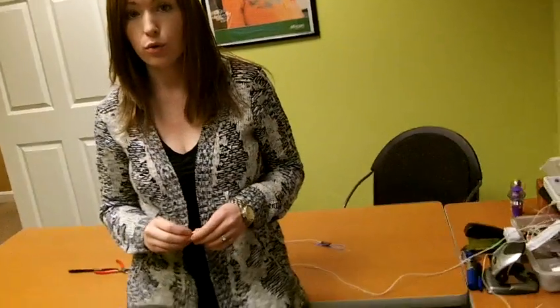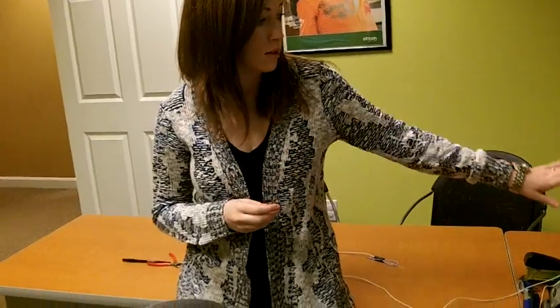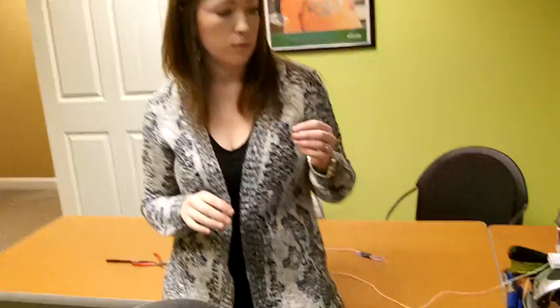Hi, so now we are going to show you how to measure an RECD. You need to measure RECD for adults and children because there is a difference between the size of the coupler and the size of the ear. Doing this will create the correct targets. Sometimes if you use average RECD, that can create targets that are not quite accurate for your patient.